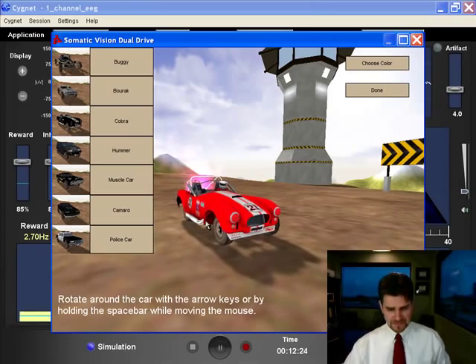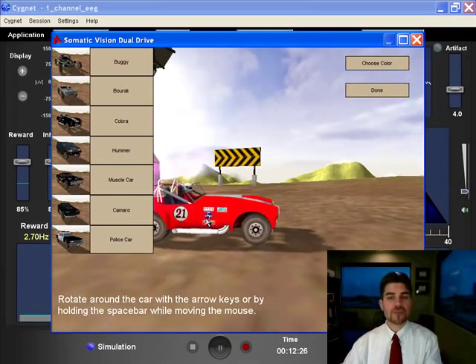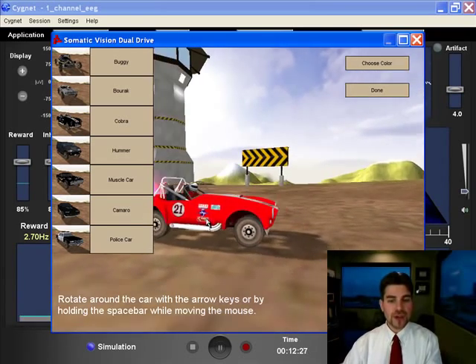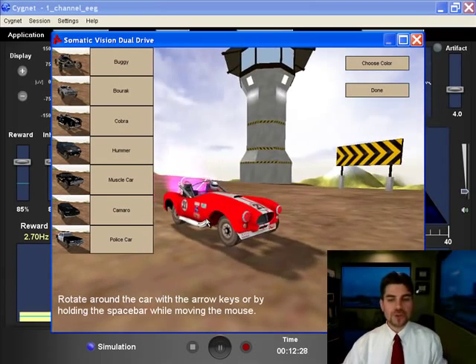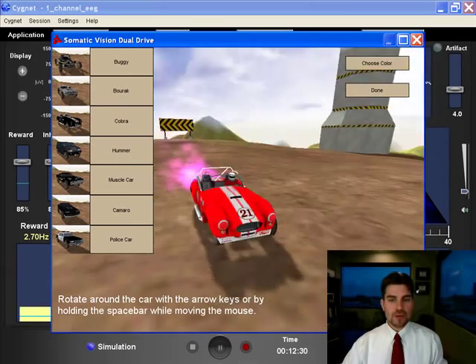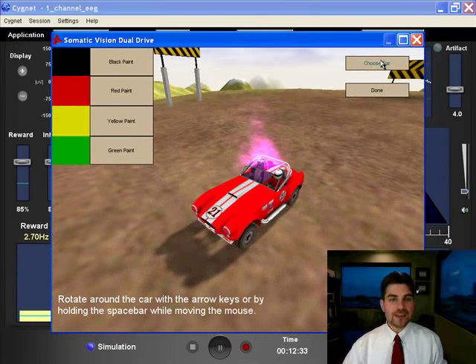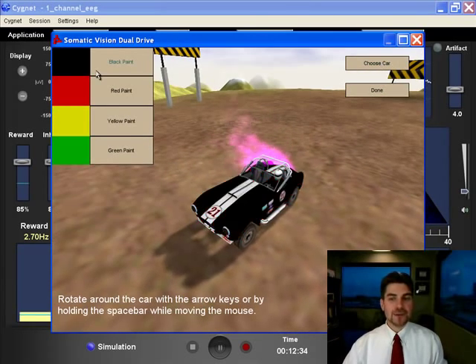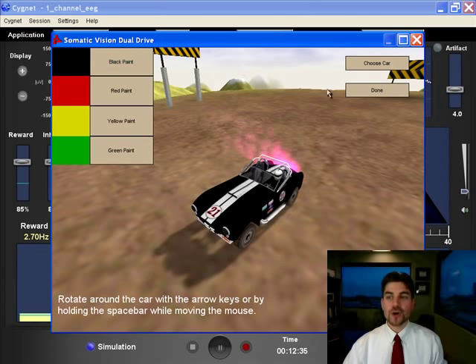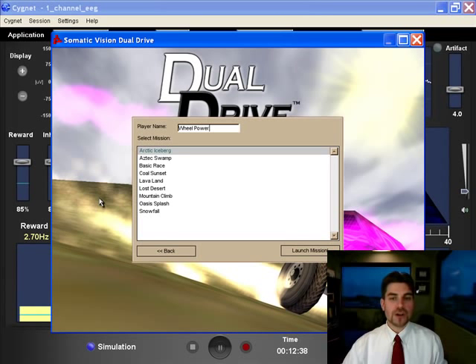And with the keyboard I can rotate around. I can also hold the spacebar and rotate all the way around the car. I can choose a color and go with a black Cobra. I hit done.